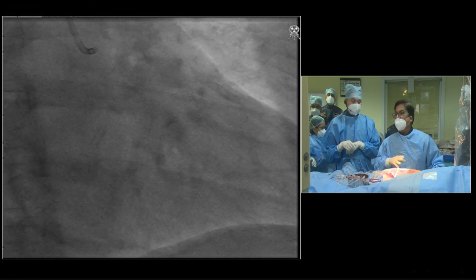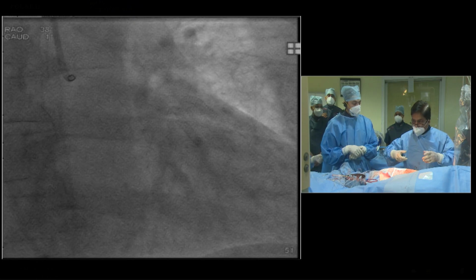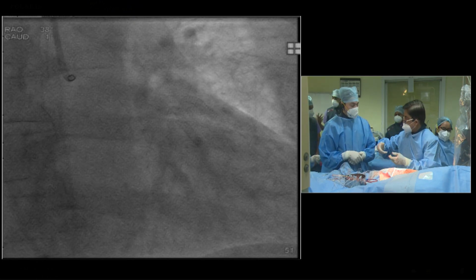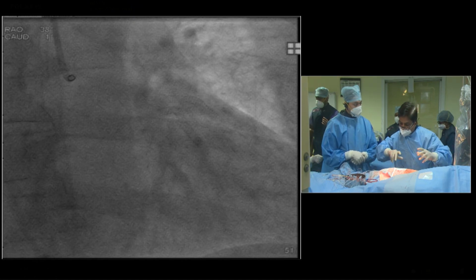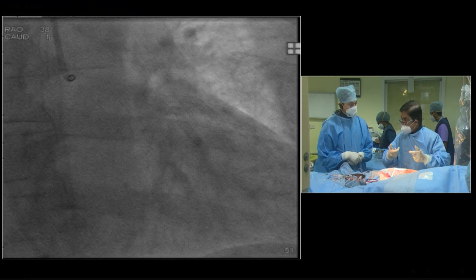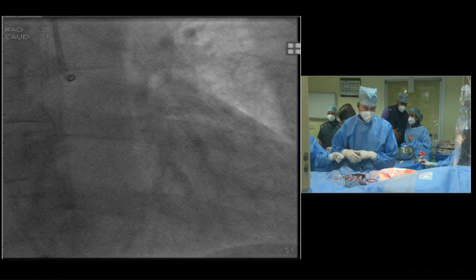And sometimes when you pull back the guiding catheter, you produce a dissection. You should tell me when you pull it. When I pulled it out, I rotated it anti-clockwise and then pulled it out smoothly, so that it is out of the mouth and then out. Here I had made it coaxial and put it in, so I had rotated it clockwise and pushed it. So when it jumps out, it can scrape the mouth. So rotate back and out. Okay? Thank you. Complete. Thank you, brother.